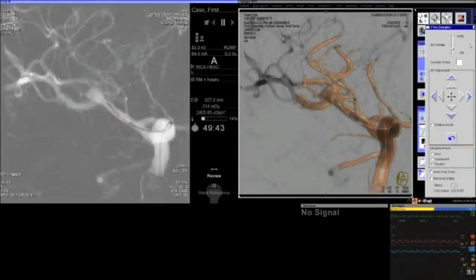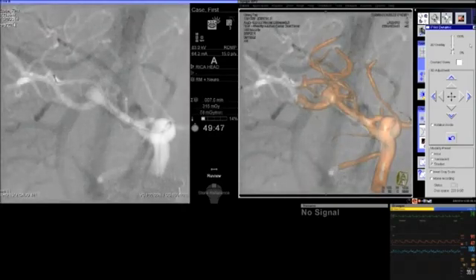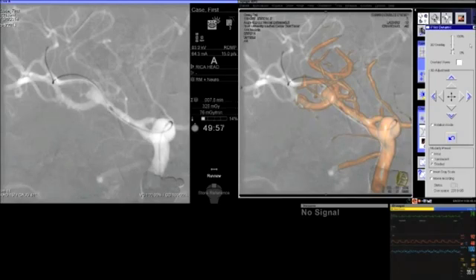This is an important aspect here. We have to do a roadmap to look at the distal anatomy. As we position the 14 wire, we want to get significant purchase into the distal vessel, but be very careful about not perforating the small vessels as the anatomy gets more distal.